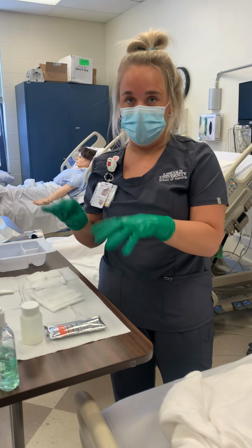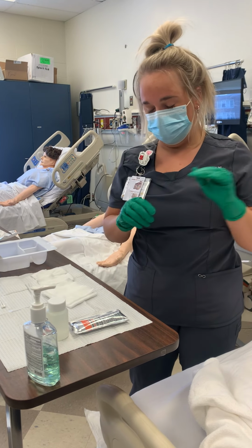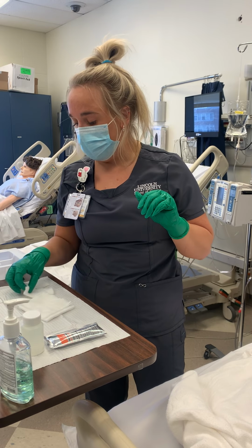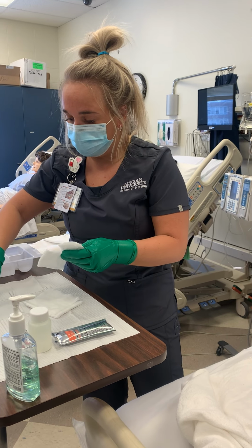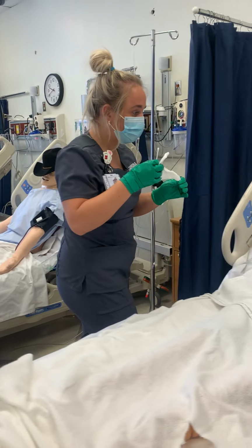At this point, I would don new sterile gloves before I put the V-sponge on. So for video purposes, I'll just keep these ones on. But now I'm sterile again, and I will be replacing the V-sponge. All right. I'm gonna come over here.